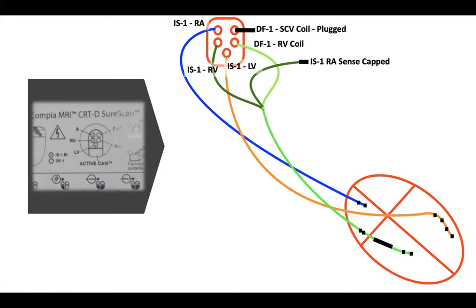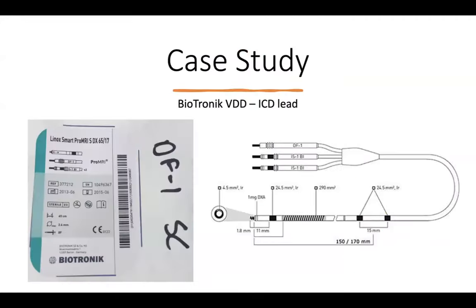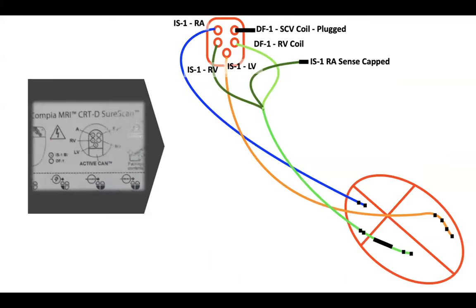So when I now positioned the high voltage ventricle here, I wanted to position the other one, the one I called you about, which was written IS1 atrium. That is what is written on it, IS1 atrium. The one that will finally be capped. So I took it to where the SVC is supposed to be. It did not fit in. Then I took it to where the atrial is supposed to be, and it fit in.